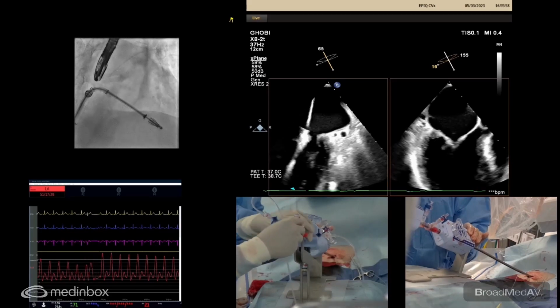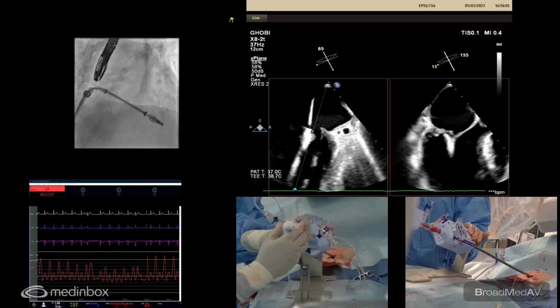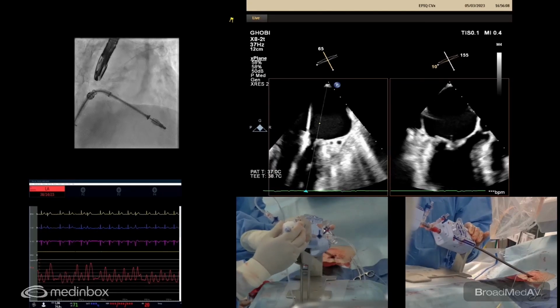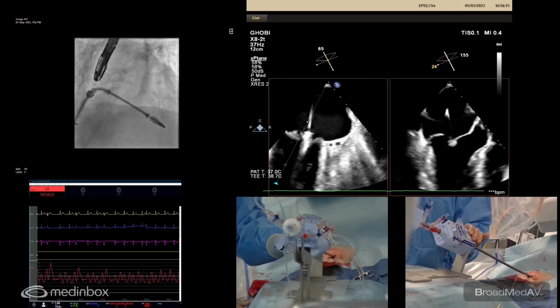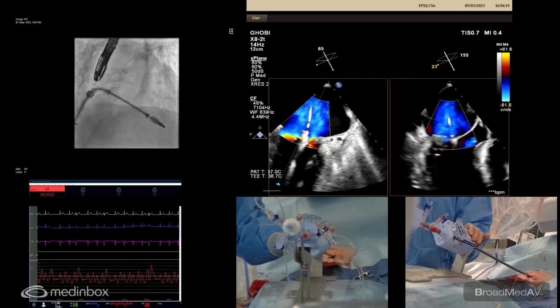There's a lot of posterior in. See, this time I like it. You see that? You see it's tighter. And this time it's less redundant. I agree. I think this is a better grasp. Yeah, right? Yeah, good shot. This is definitely a better grasp. Yeah. Elevation is good. On the medial side, you have a little bit of prolapse. That's right.